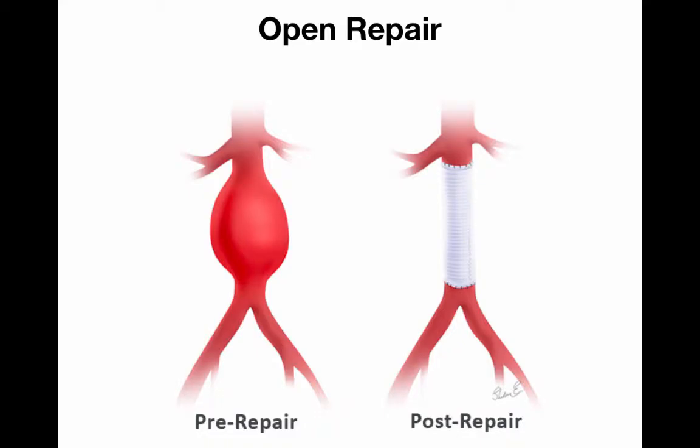So thus far we've talked about finding the abdominal aorta with ultrasound. We've gone over what AAAs look like. We've talked about what ruptured AAAs look like. And we're going to spend a little time now talking about endovascular grafts. These are being done more and more commonly, particularly in patients with unruptured AAAs. Before I really got interested in abdominal aortic ultrasound, I have to admit I was not completely clear on the difference between an open repair and an endovascular repair. So we're going to go through that very quickly.